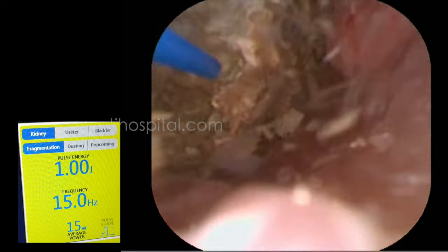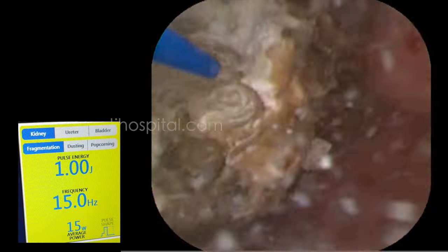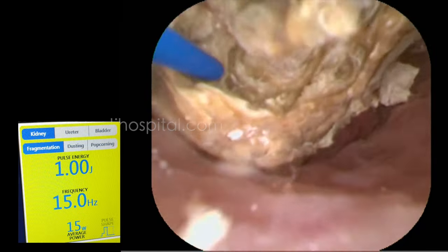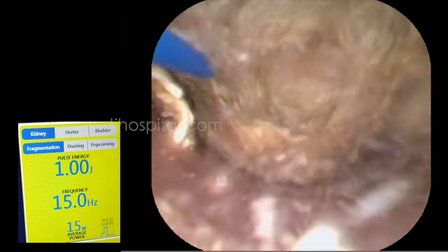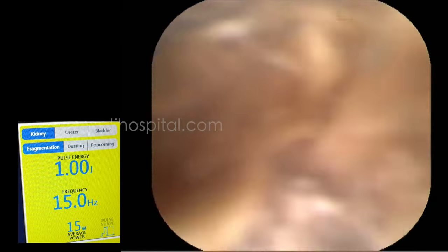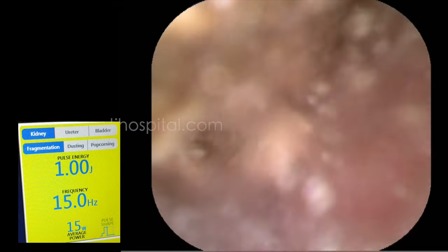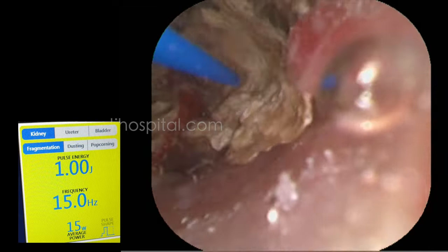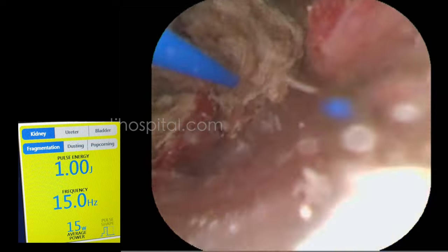Ideally they are disposable and one should keep an eye on that, but here that was not the problem; fragments were coming out. Slowly the volume inside the kidney decreases faster because the fragments are evacuated immediately. Previously we used to make too much powder, and the powder used to come out by itself. Now that need is not there. The volume here is approximately more than 1800 mm cubic.